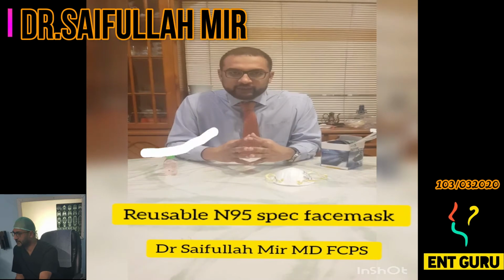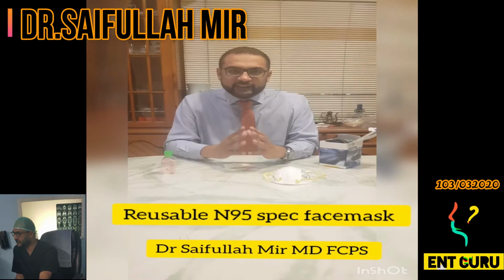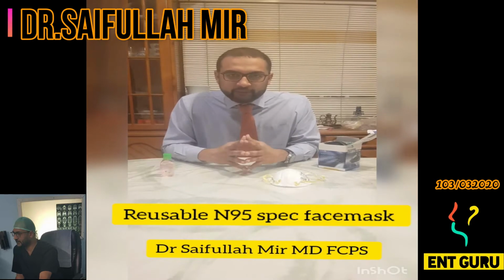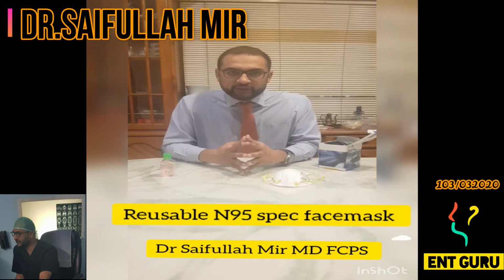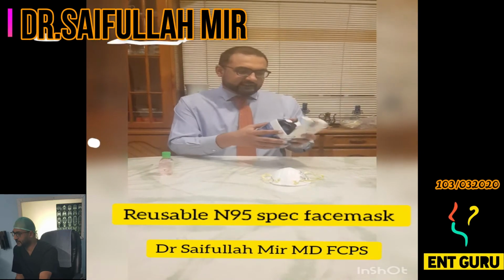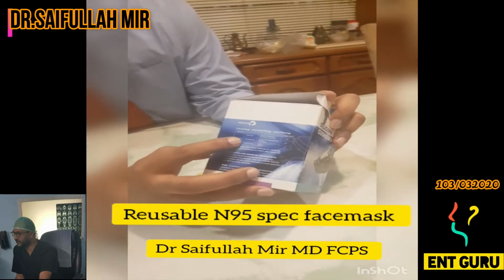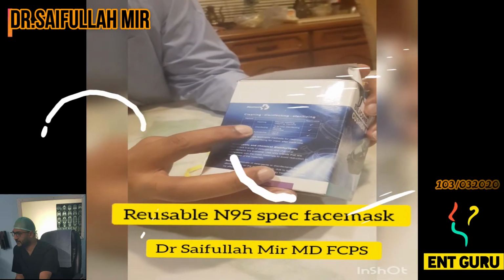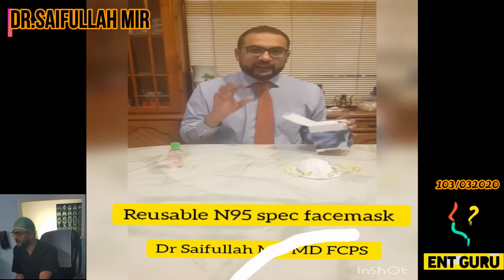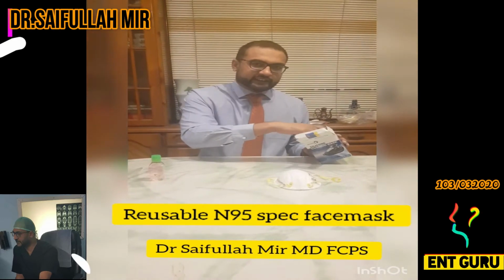as a surgeon, we innovate in times of need. And my innovation in this is a reusable N95 specification mask that you can easily make with the equipment in your hospital that is autoclavable and reusable. So there is no need to work without personal protective equipment. Again, the equipment that you would need is a silicone cushion mask, which is autoclavable, washable. You can disinfect it with a variety of substances and autoclave it. So you can use it again and again. You can have four masks, label it day one, day two, day three, day four, and keep autoclaving it.